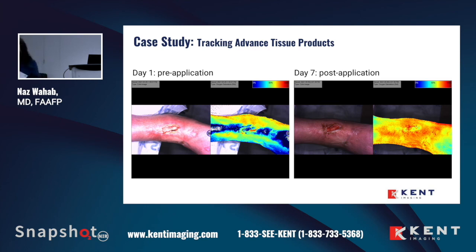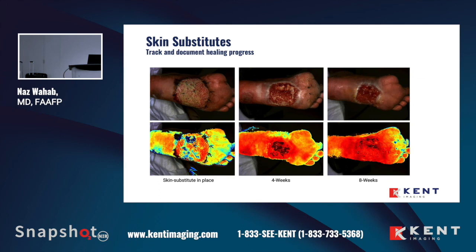And it doesn't always have to be with healing outcomes. We would love to all have healing outcomes, but unfortunately, sometimes healing outcomes are not the only thing that we're looking at. Here's another one that you can see. You can track the progression. So again, there's a skin substitute here in place that's been sutured after a debridement.